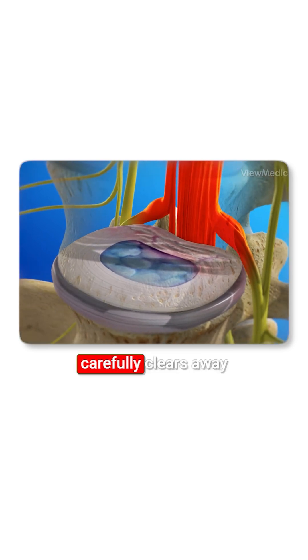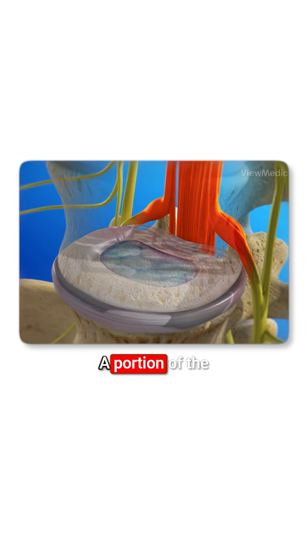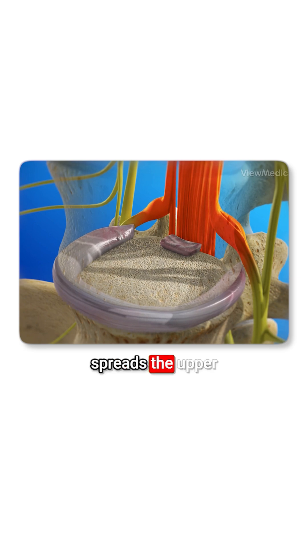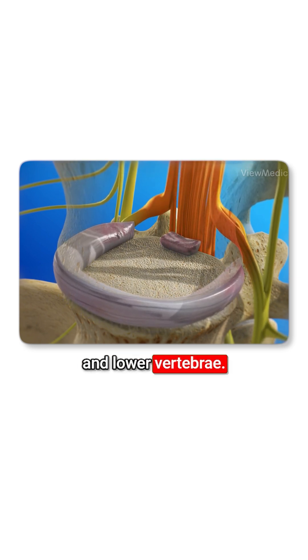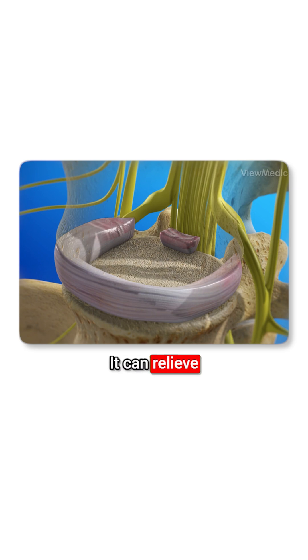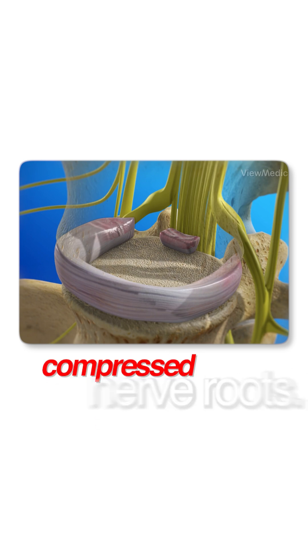The surgeon carefully clears away your damaged disc material. A portion of the disc wall is left in place to help contain the graft material. The surgeon spreads the upper and lower vertebrae to properly align the spine, which can relieve pressure from compressed nerve roots.